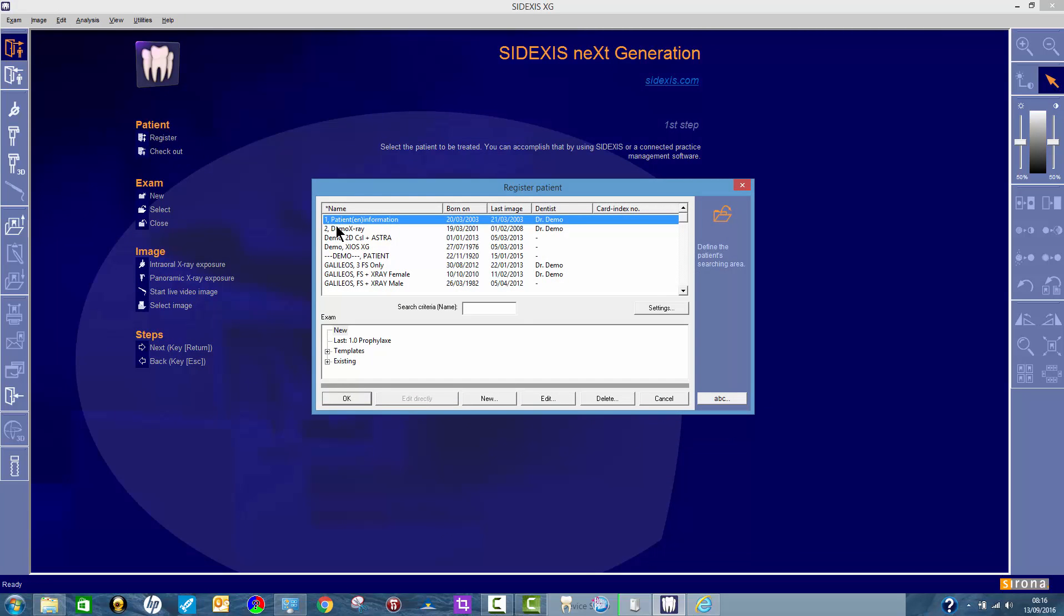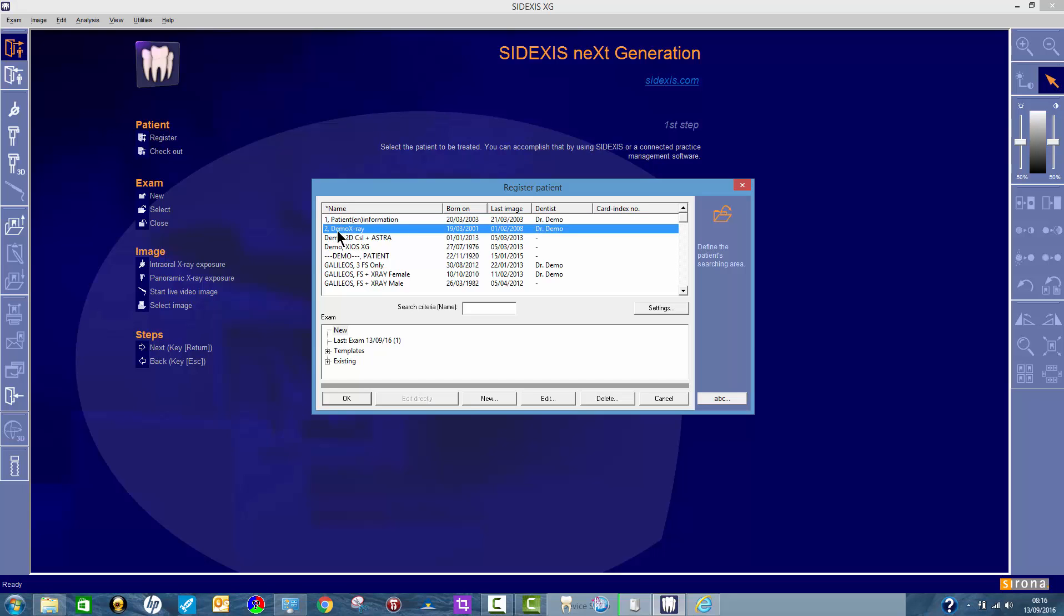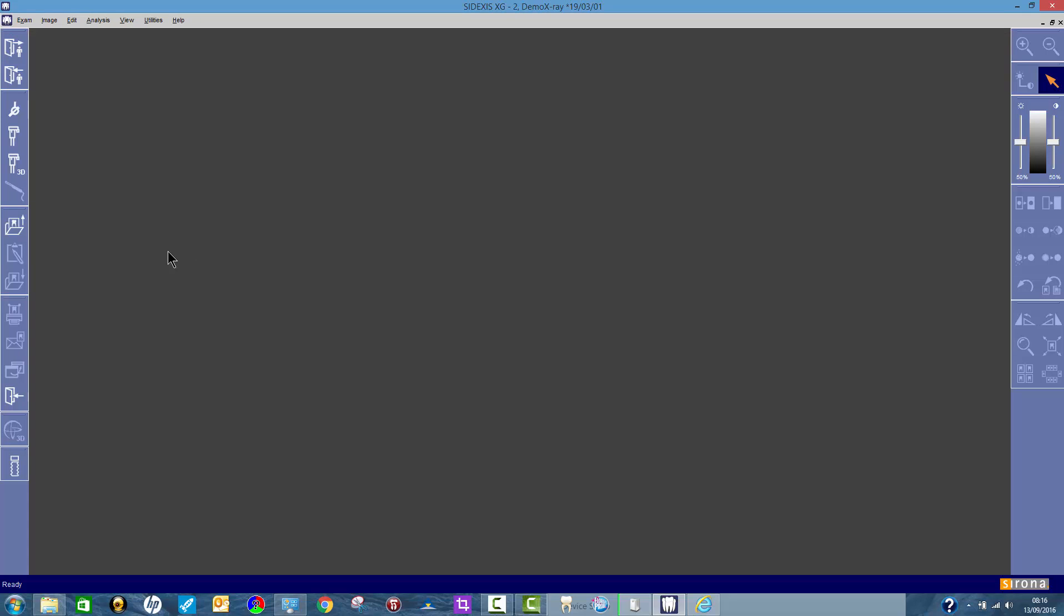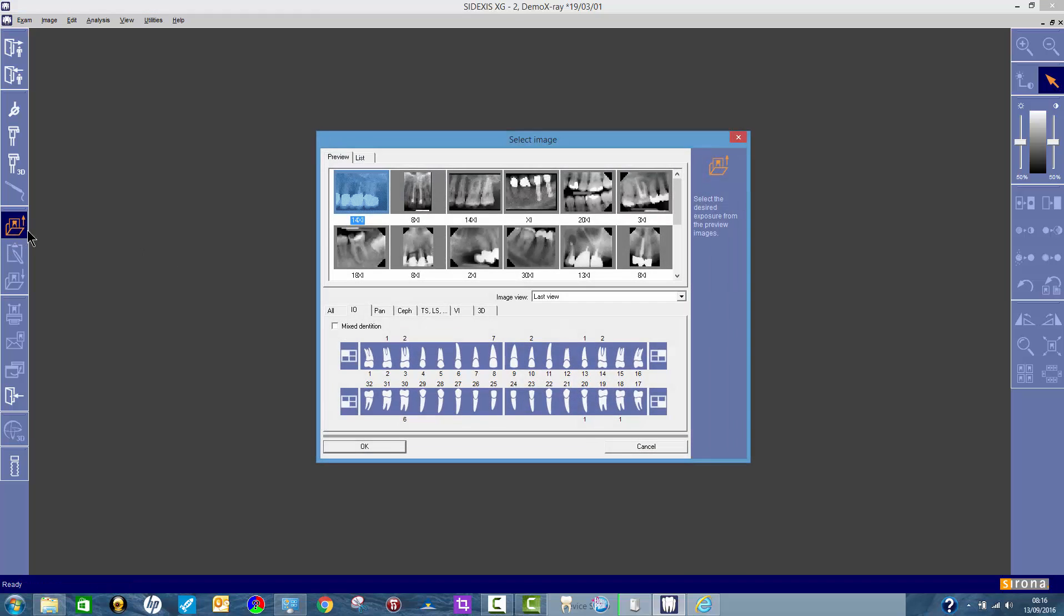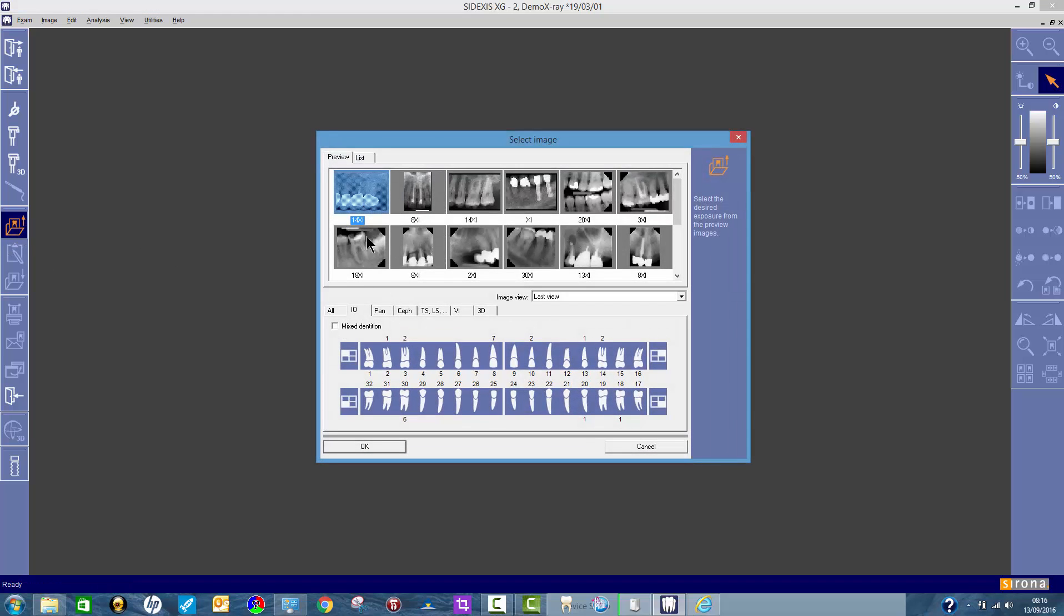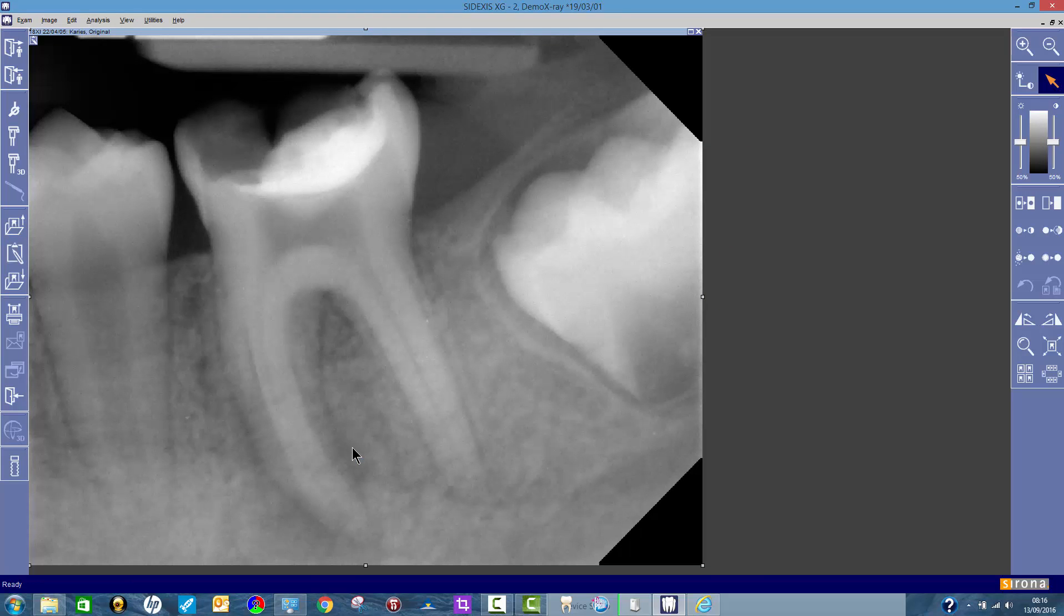First of all, find the images that you want. This patient is called Demo X-Ray. Find the images that you want to burn to discs. For example, you want that one and that one. I'm just holding down my control key to select more than one. Click on OK.